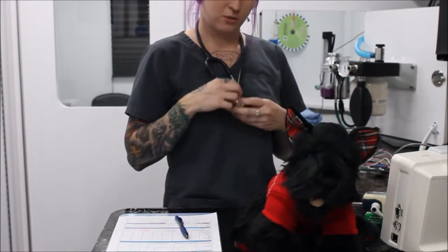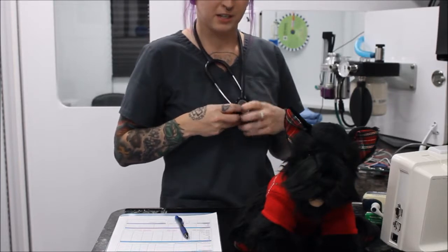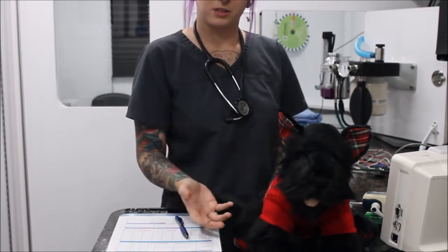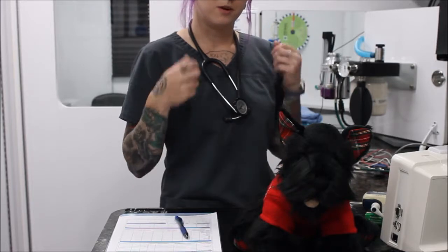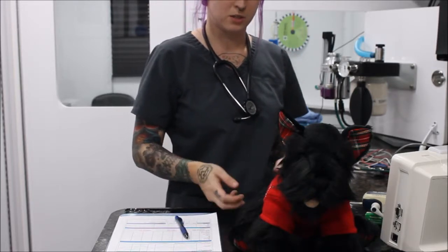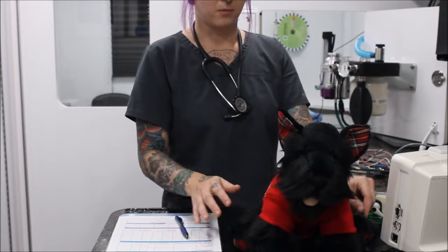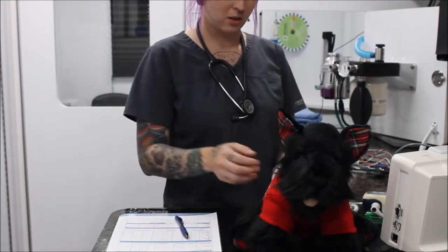Another way to monitor heart rate would be through stethoscope. And if your patient's under anesthesia, you can either use a stethoscope and listen from the outside, or you could use an esophageal stethoscope, basically down the esophagus. It just makes it a little bit easier, and it's right next to the heart, so you have a nice good sound, so you don't have to mess around, especially, again, depending on the type of procedure that's being done, in case you don't want to get in the way of the procedure.